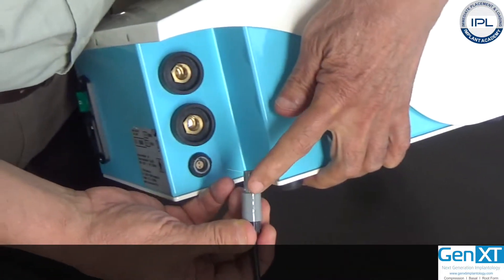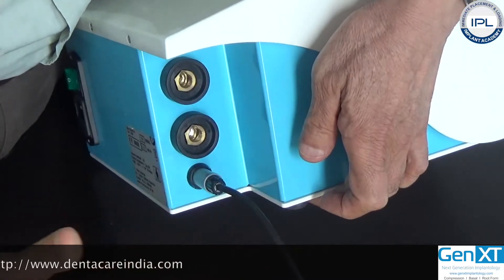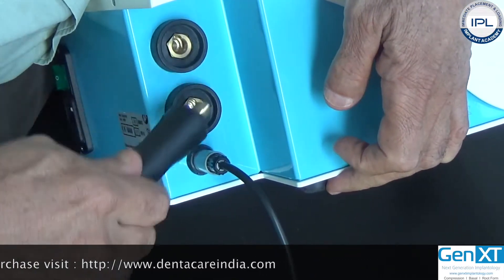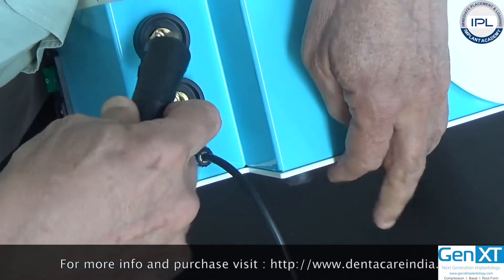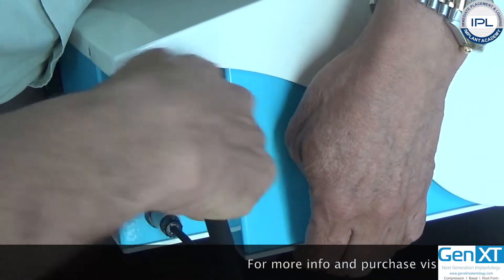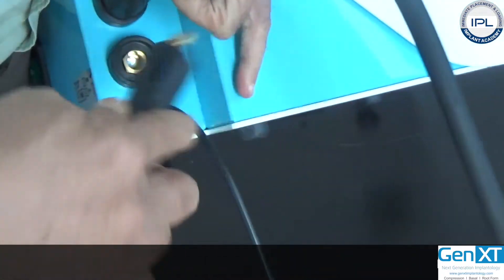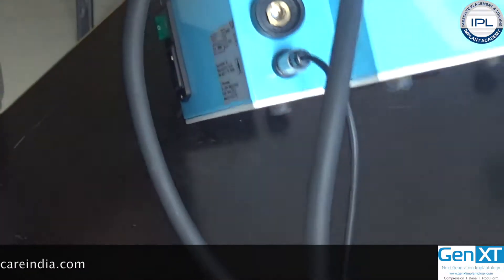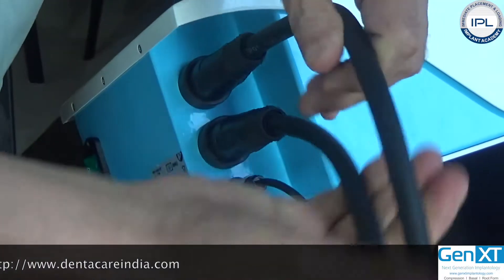To connect the foot switch, you see this male extension and a matching receptor. You coordinate the two and push it inside. I am turning it to the right to lock it into place — just push it and connect it. Coordinate the two and turn it clockwise until it is fastened.